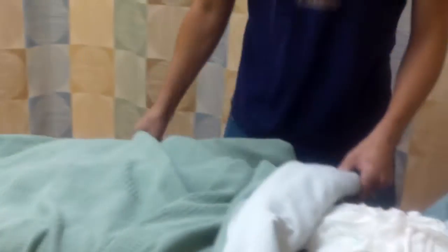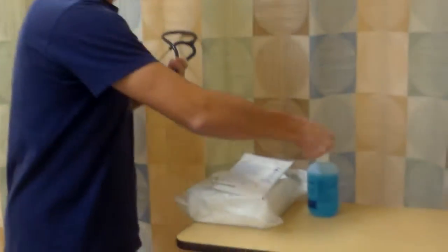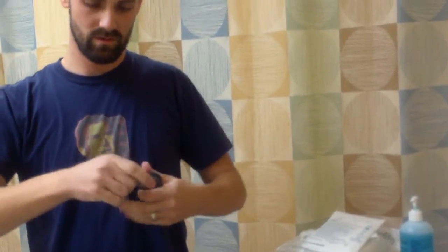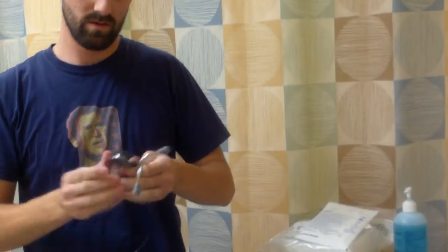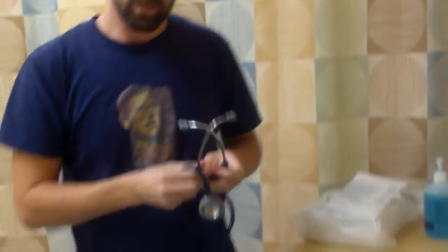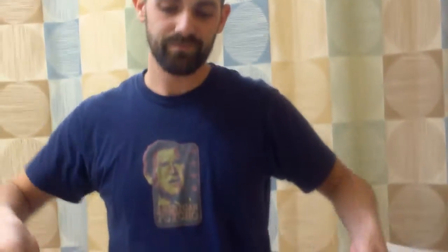So once that's done, now I'm going to make sure I have a clean stethoscope before I begin. I'm not going to clean one cotton ball at a time. It's good. Get all that. Wiping one and done, front to back. Okay. So then with the abdominal assessment, I'm going to be doing inspection first.